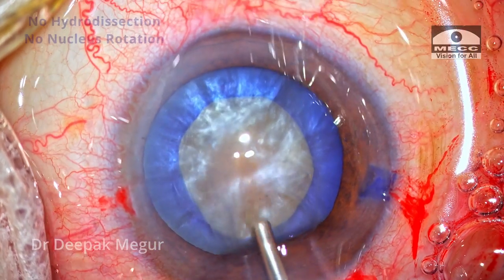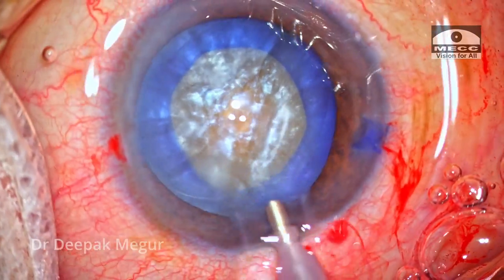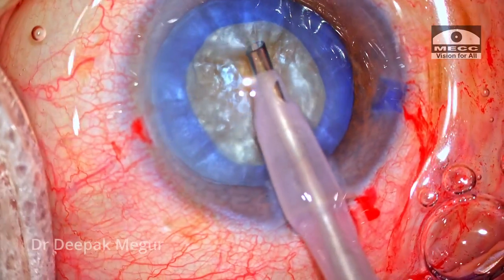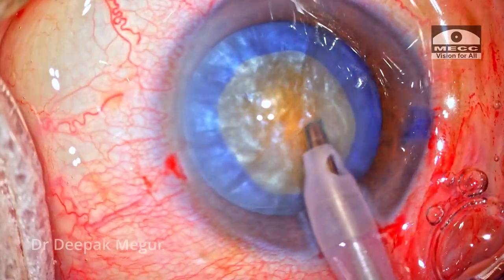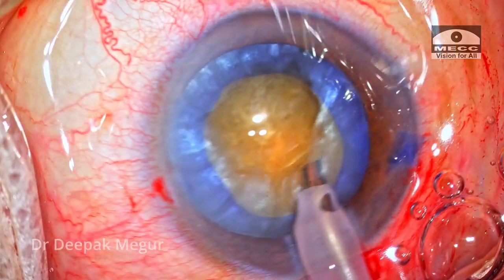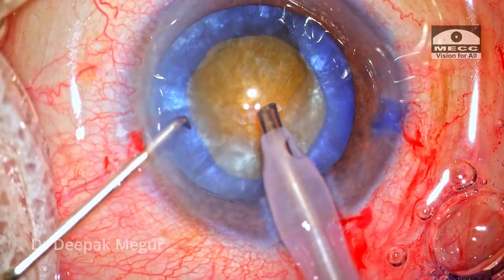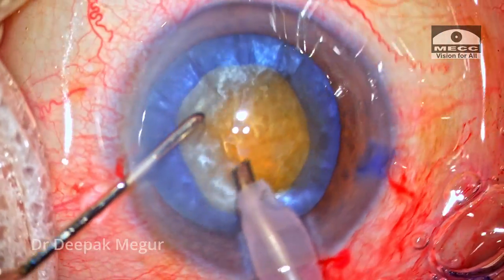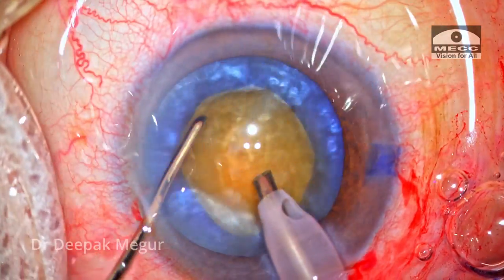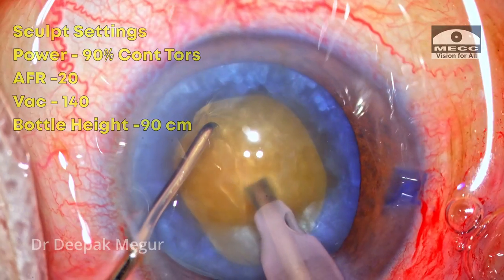Since it's a mature intumescent cataract, I'm not doing any hydrodissection and there's no nucleus rotation. I directly go in with my FACO probe. The initial settings are for epinucleus removal, and the superficial epinucleus and cortex are aspirated. The nucleus is manipulated with the second instrument to ensure it is free. The underlying nucleus is slightly brunescent. I'm going to create a small trench and then divide the nucleus into smaller fragments using the vertical chop technique.